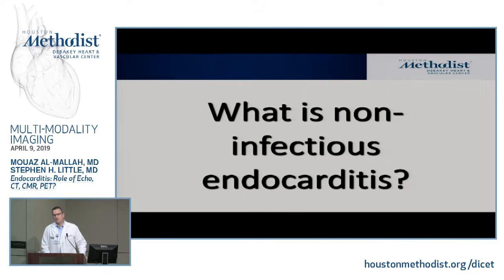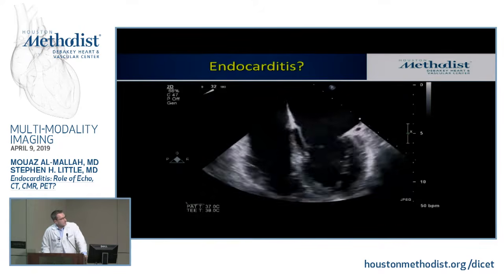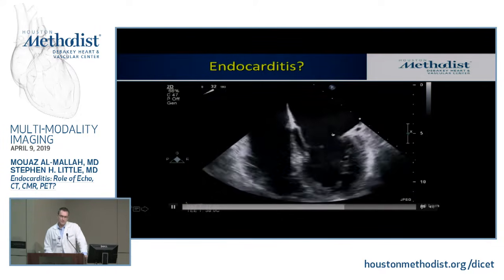Okay, so just a slide or two about non-infectious endocarditis, because you do have to be thinking about that. That's not as much a diagnostic, differential, an imaging differential, but as a clinician, you certainly have to be recognizing this entity. So this is an example. And you see here, you see the mitral valve. We focus your attention here. And it doesn't quite follow the rules we've already discussed.